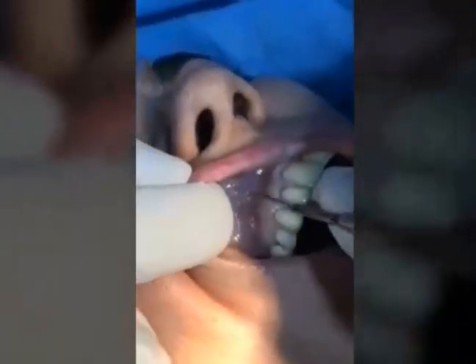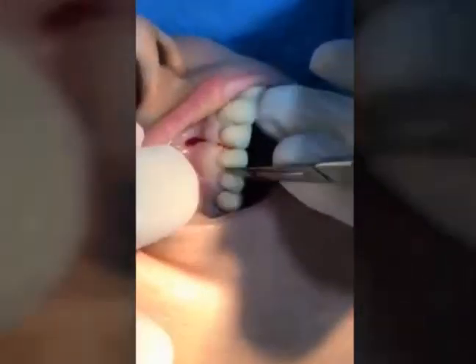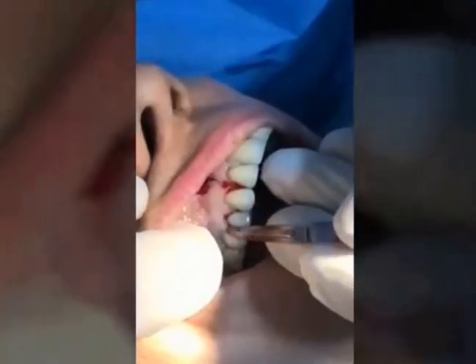Starting with the incision, we are doing the vertical incision, then the horizontal incision — also known as the intrasulcular incision or reverse bevel incision.